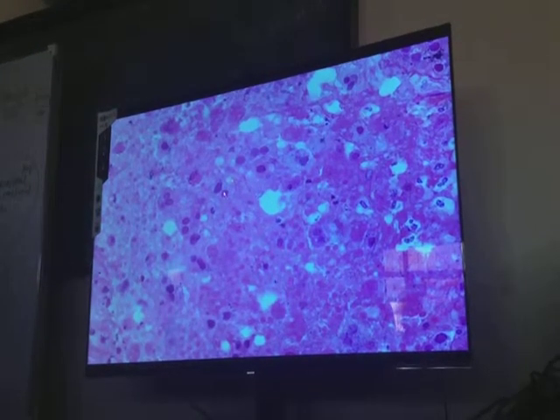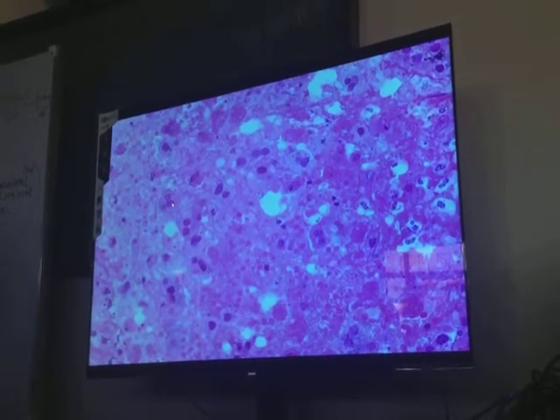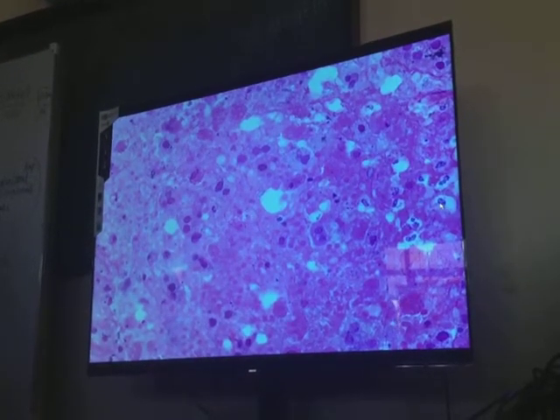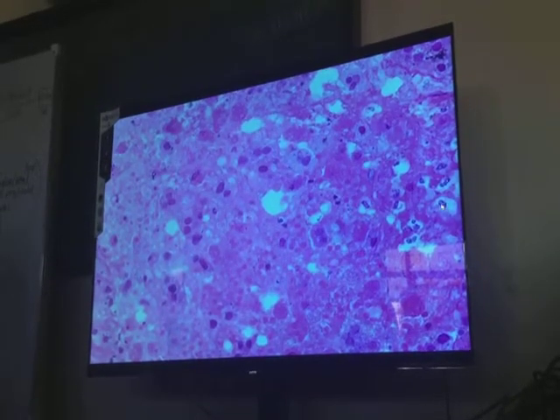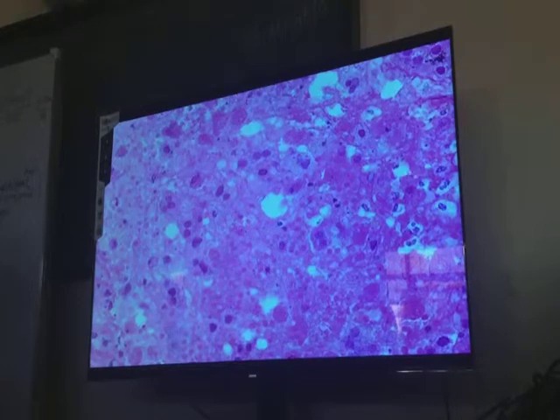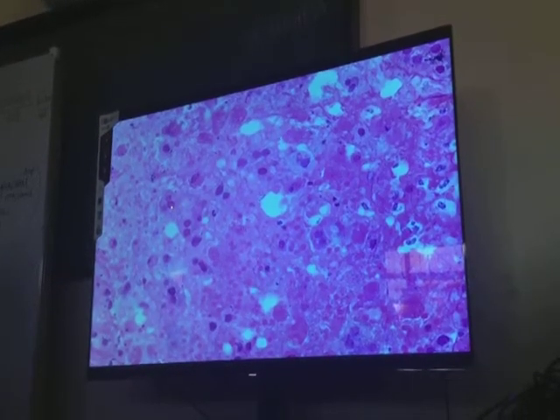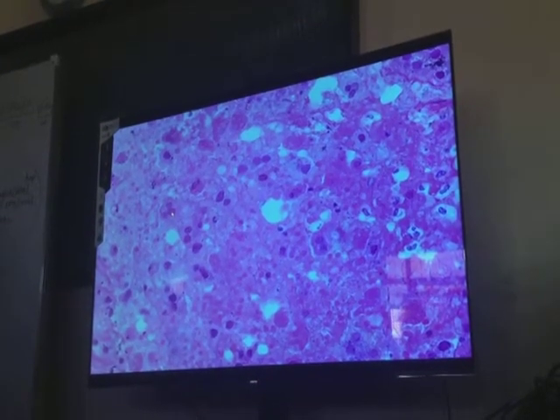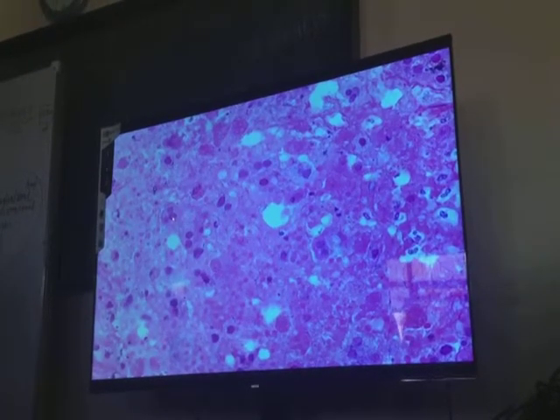Okay. So these are the diseased liver cells. The nuclei, what is absent in their nuclei already? Nucleolus. So that should be the appearance of the normal nucleus of the hepatocyte. Okay? So there is a clear space surrounding the nucleolus. How will you describe the appearance of the nucleus of the cell pointed? Enlarged. What else? Mayroong eosinophilic inclusions.